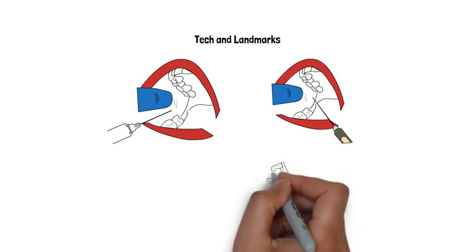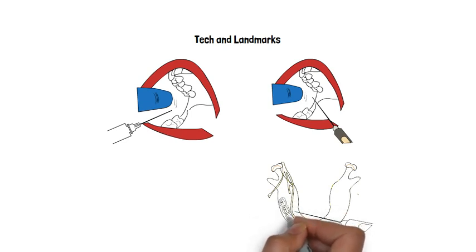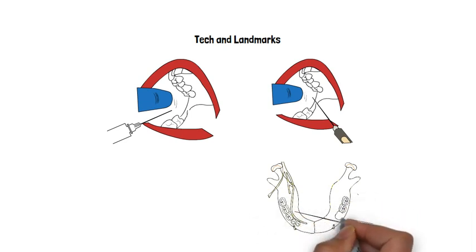There is another type of lingual nerve block called partial lingual nerve block that is used in conjunction with the incisive nerve block. In this technique, using a 25 gauge long needle, deposit about half a ml of local anesthetic under the lingual mucosa just distal to the last tooth to be treated.